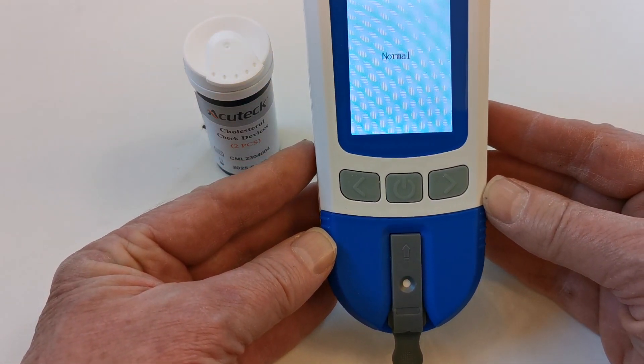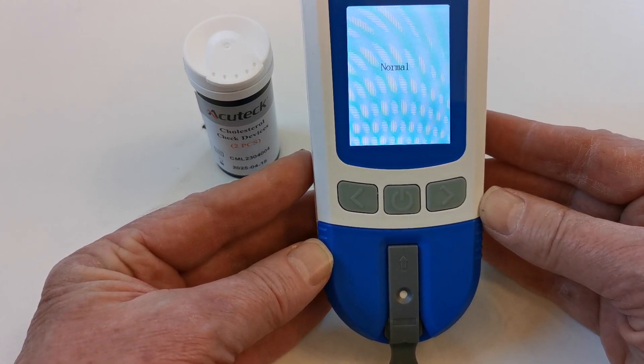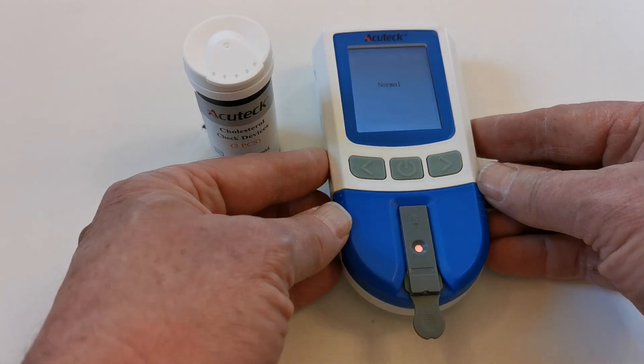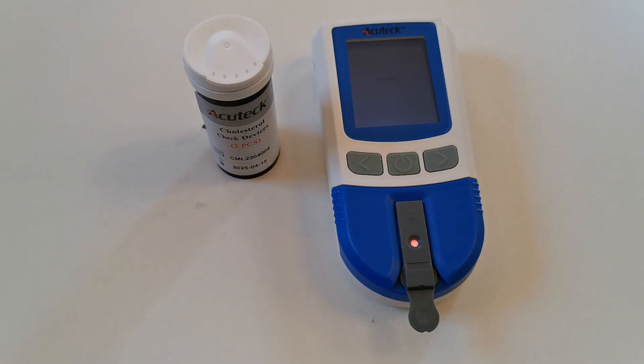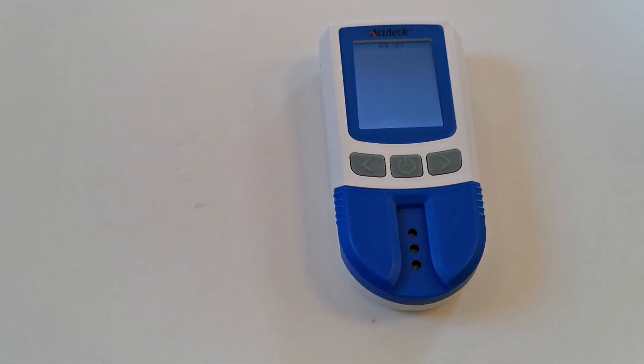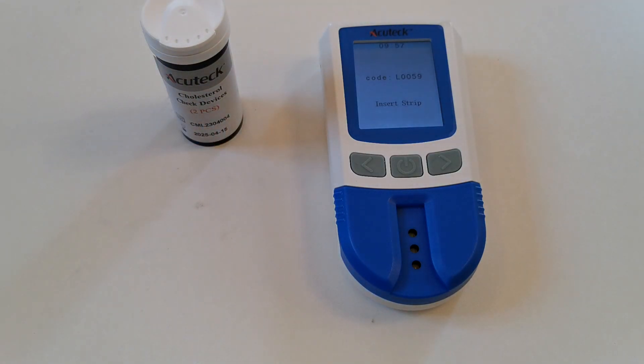You can see the countdown here, and if the meter function and optics are all functioning normally, then you will get a normal reading display as shown. The check device test is now complete. The device can be removed and reinserted into the storage pack. The meter can now be powered down.